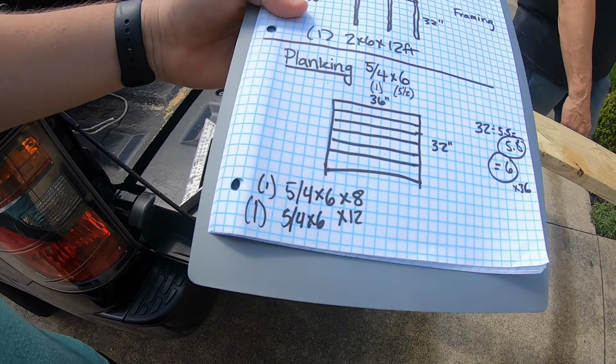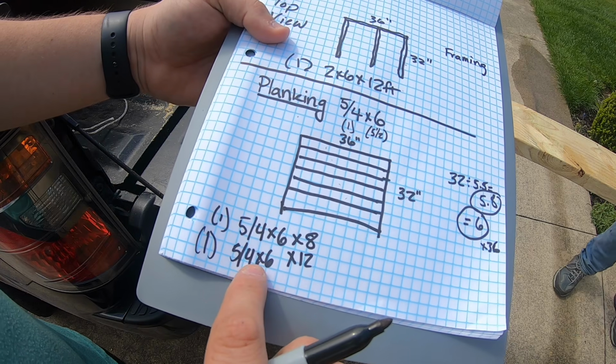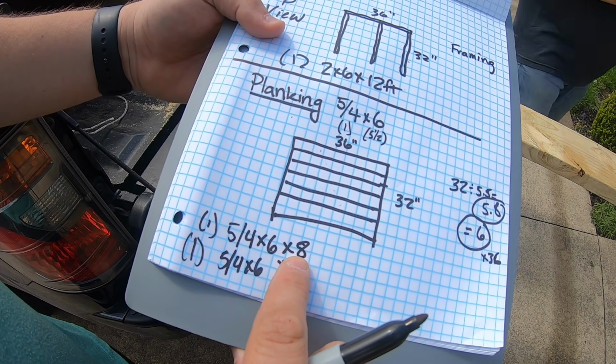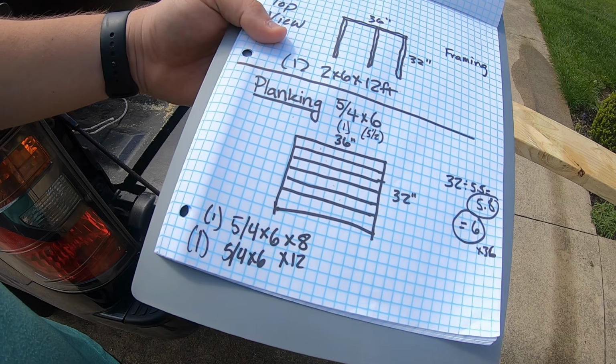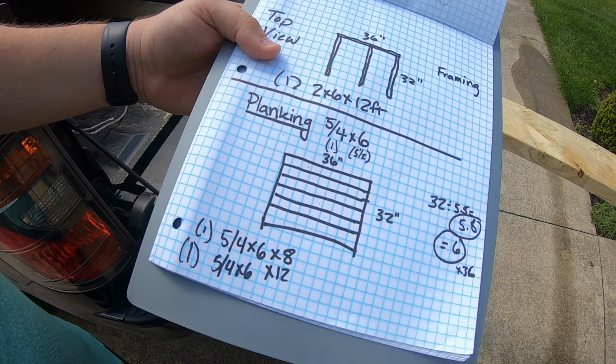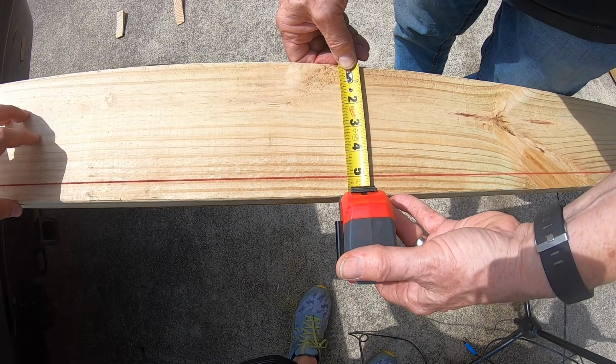So with this, we're going to go ahead and buy a 5/4 by 6 by 8 foot and a 5/4 by 6 by 12. Our store does not carry a 6-footer, which is exactly what we would need. So we have to round up to an 8, and that will give you each one of these boards here.